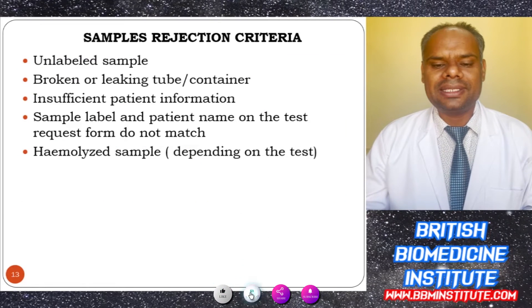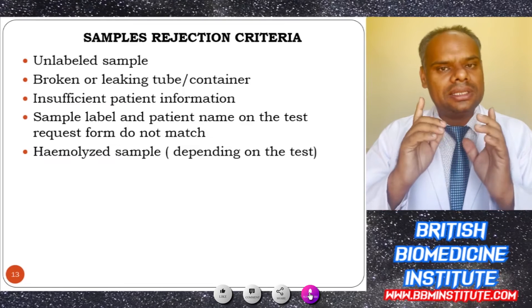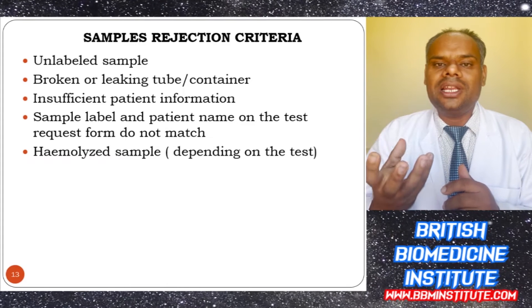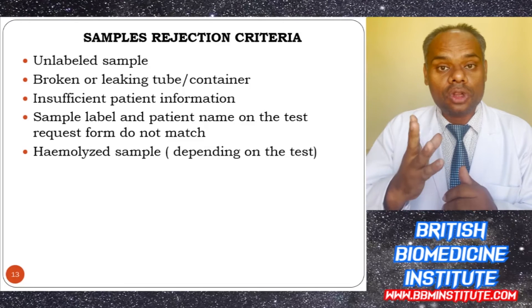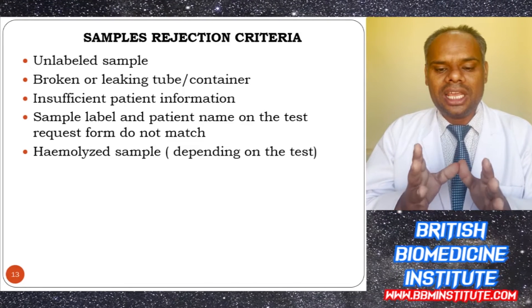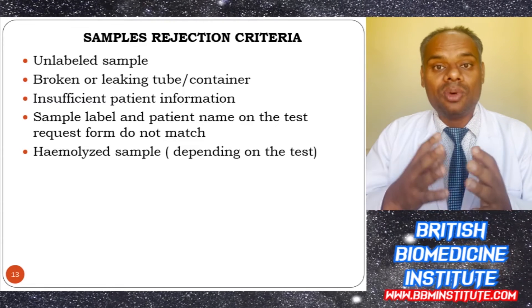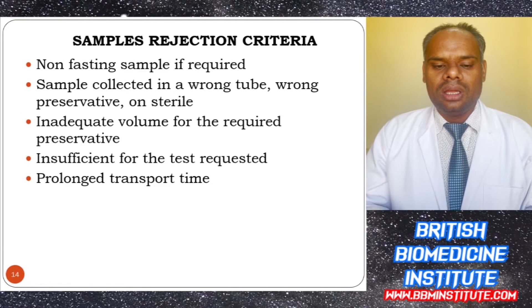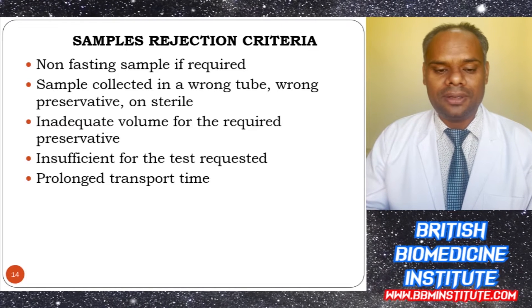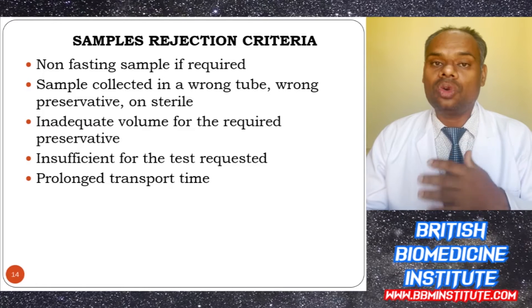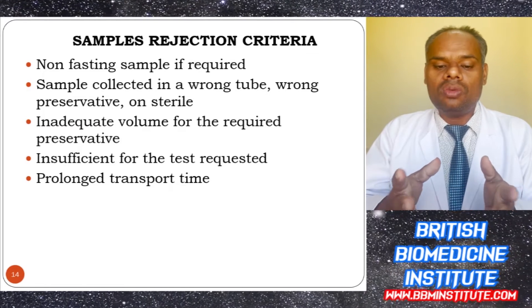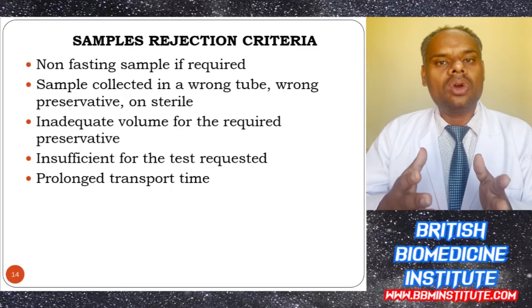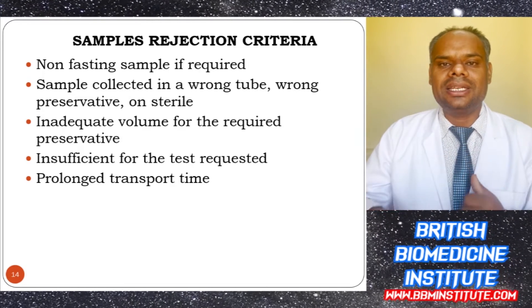Sample rejection criteria can be due to: an unlabeled sample; a broken or leaky tube or container; insufficient patient information; a mismatch between the sample label and the test requisition patient name; a hemolyzed sample depending on the test; no fasting sample when required; sample collected in wrong tubes or with wrong preservation; inadequate volume of required preservatives; insufficient volume for the test requested; or prolonged transport time.